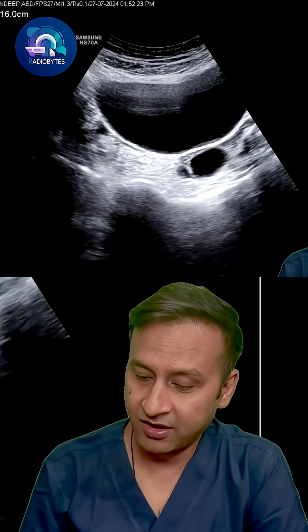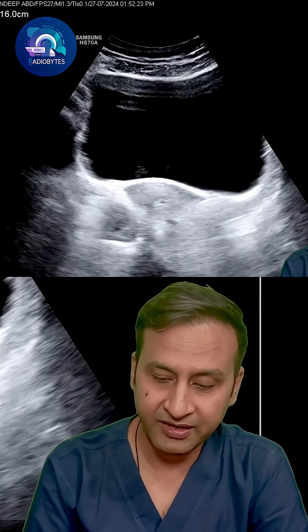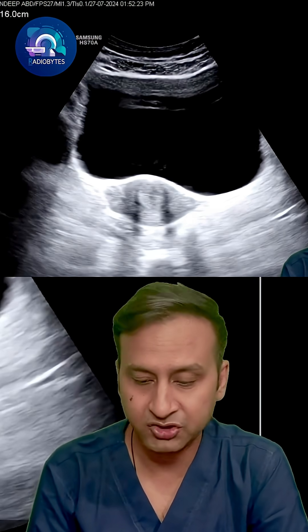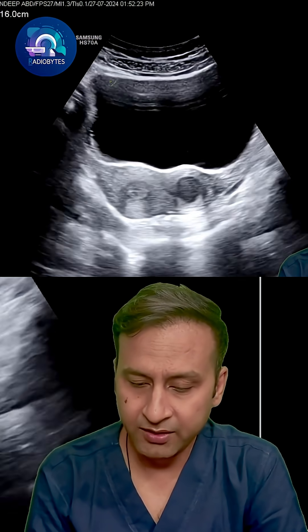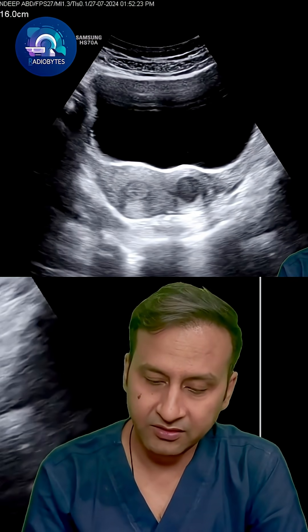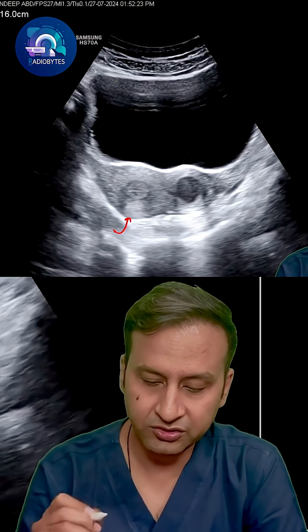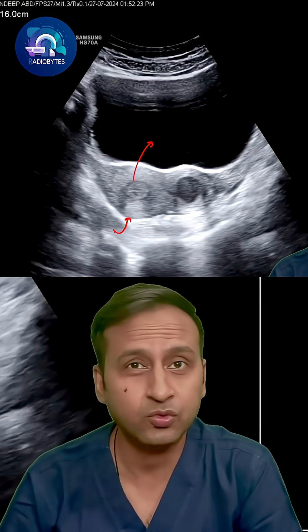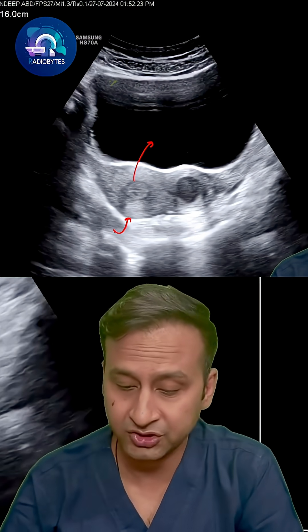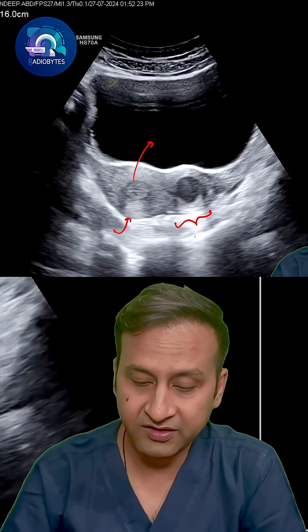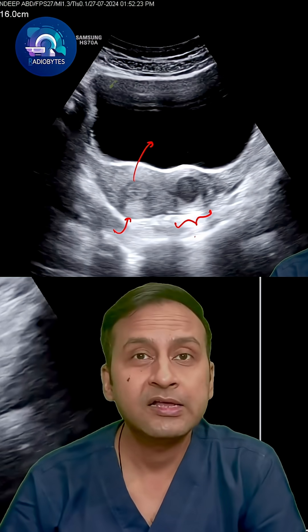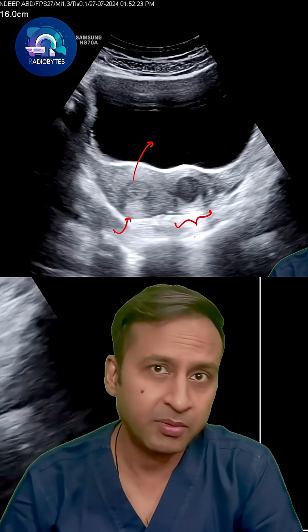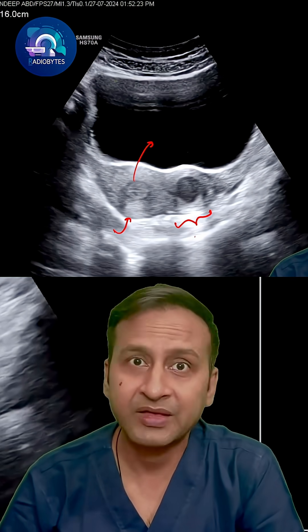Let's have a look at the case from the beginning once again. So this is the cervix — this is the region of the cervix which looks normal, and when I'm going superiorly I can see the uterus looks apparently normal. The endometrial thickness is defined, I don't see any endometrial lesion, but there's something that I'm seeing on the left side of the uterus — that is in the left periuterine location, or you can say it is probably in the region of the left broad ligament.